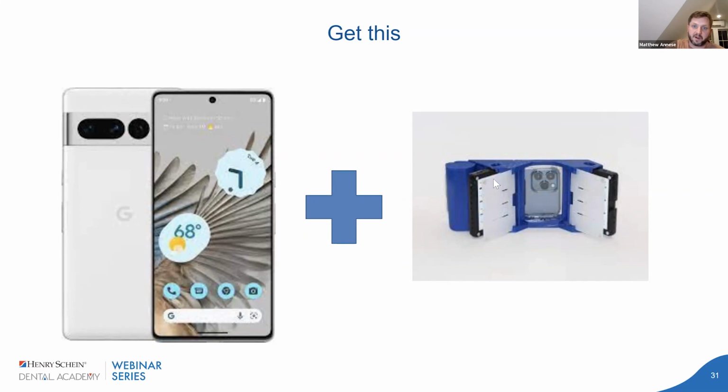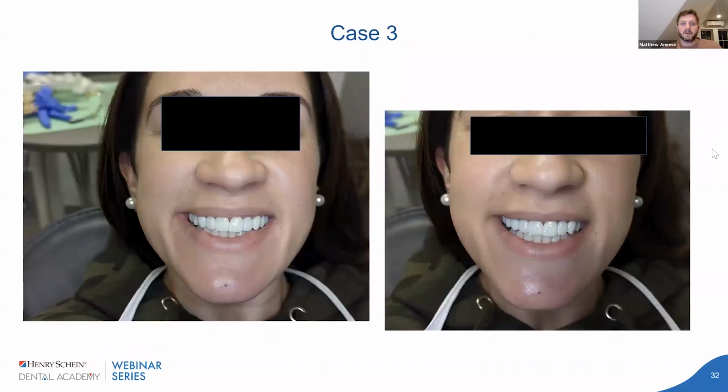Again, this light box is like $400, $800. You're all in for some of the best quality camera systems you can get, and then you can have access anywhere. So it's a pretty cool little setup that we've just used in both offices. The team really likes that they're not using their own cell phone, so when the kids go through their phone, they're not seeing all the teeth as well.